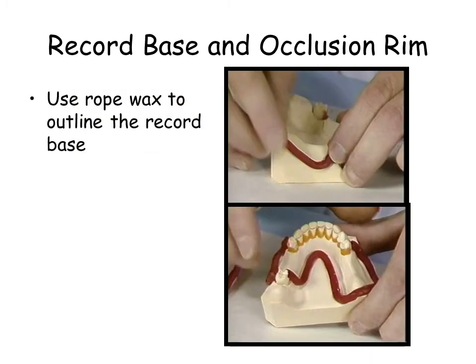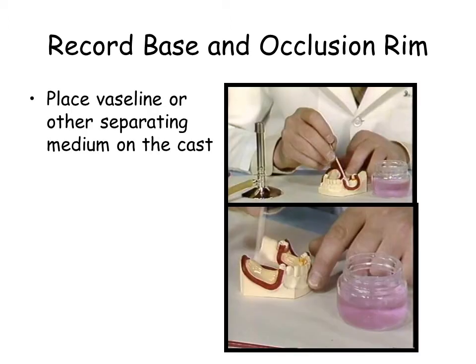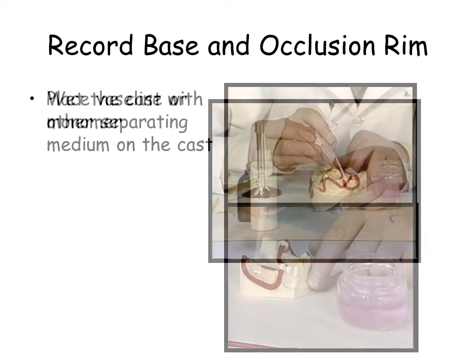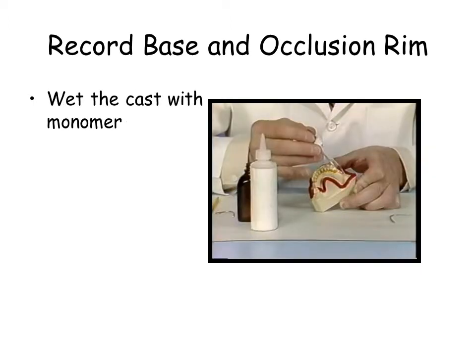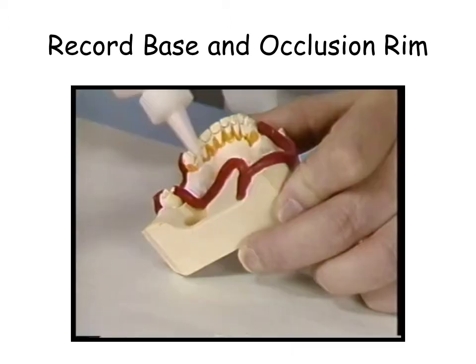Place separating medium on the cast. Wet the cast with acrylic liquid. Sprinkle the cast with powder. Alternately sprinkle powder and liquid until the base is 2 mm thick.